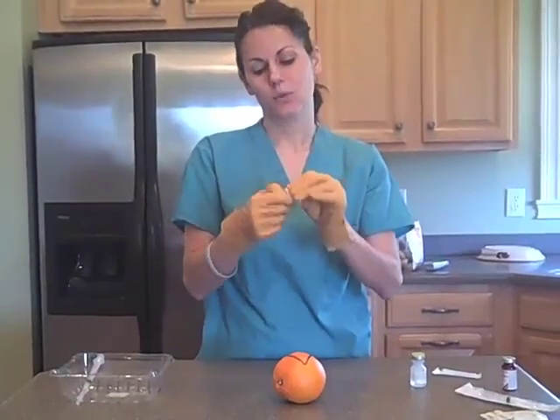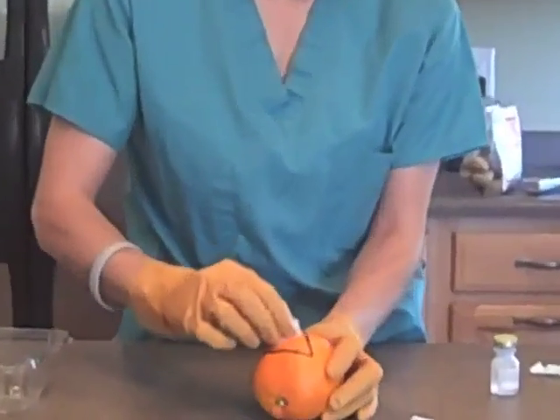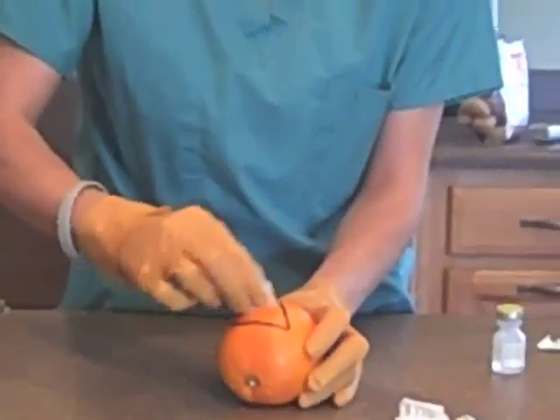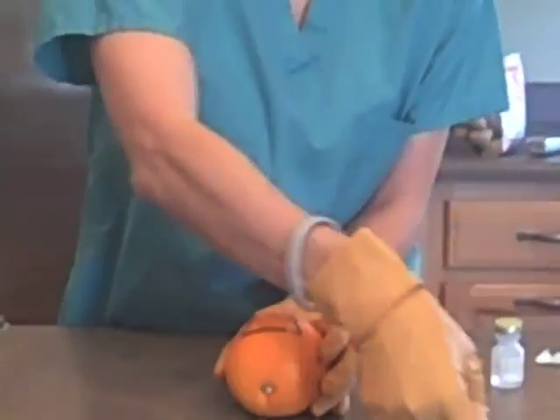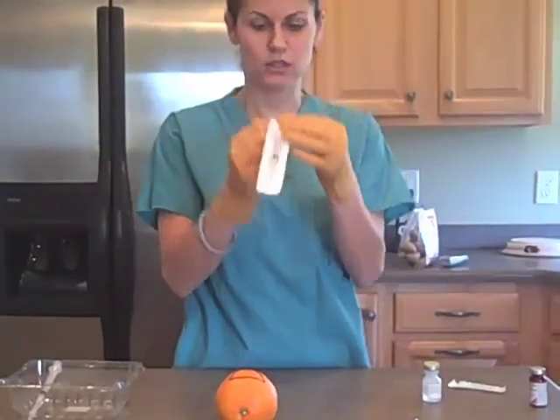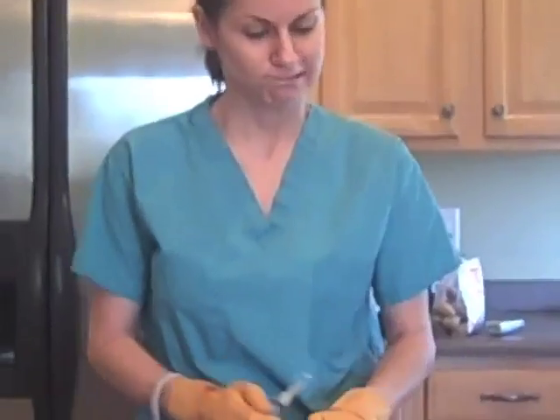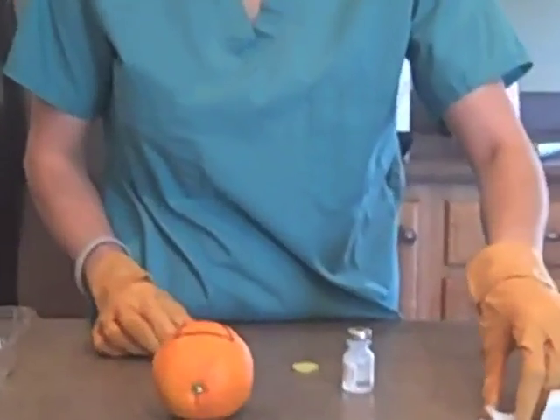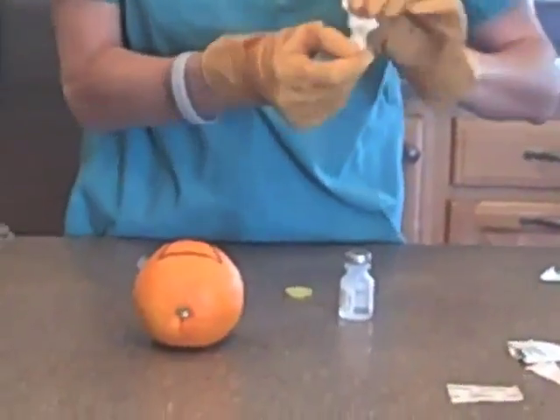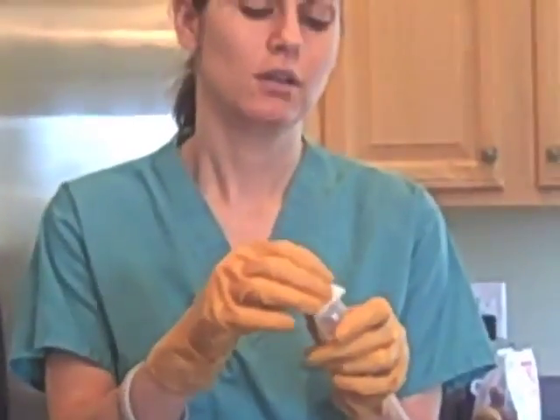And then we take an alcohol swab and clean off the area. We allow that to dry, and while that's drying, we take our sterile needle from the package and we open the multi-dose vial. We then wipe off the top.